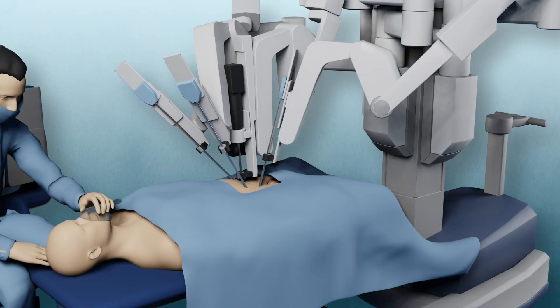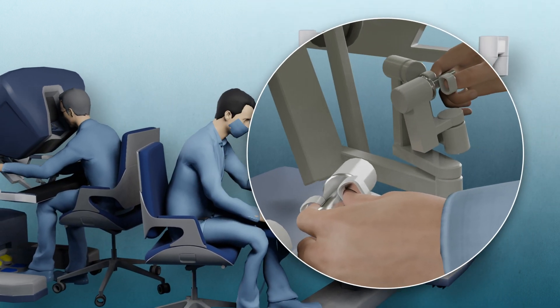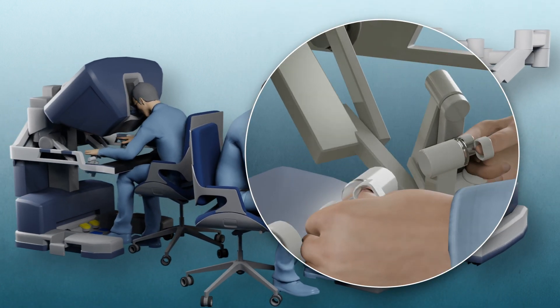The surgical tools are attached to the arms of a robot. These arms are controlled by the surgeon with a console which is placed next to the operating table.